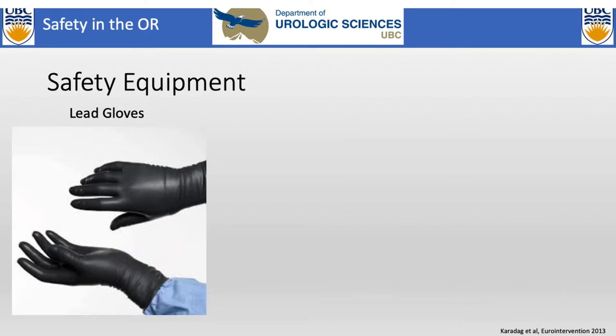Lead gloves, they seem to make sense, because your hands are obviously in close to the field, especially with PCNL when you're trying to get access. Wearing lead gloves doesn't actually help.